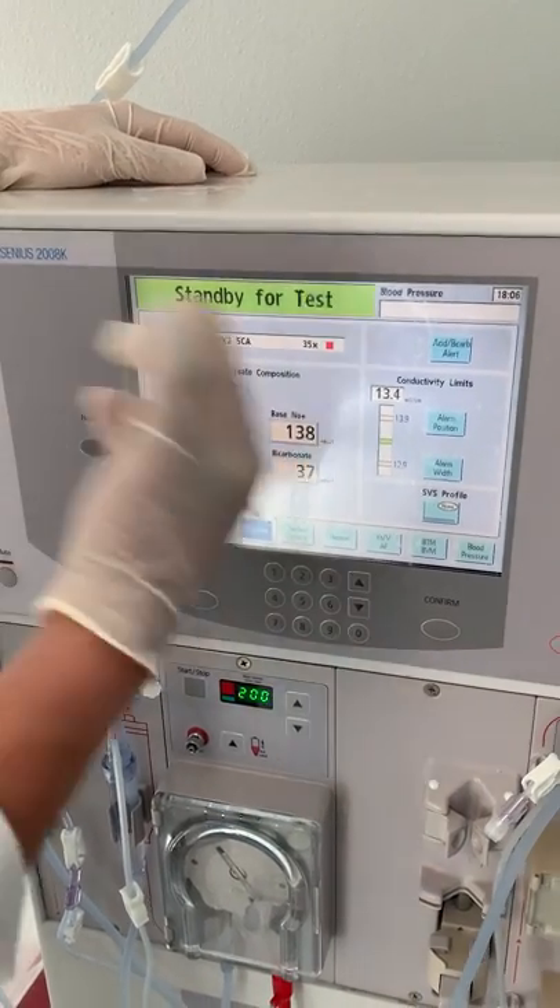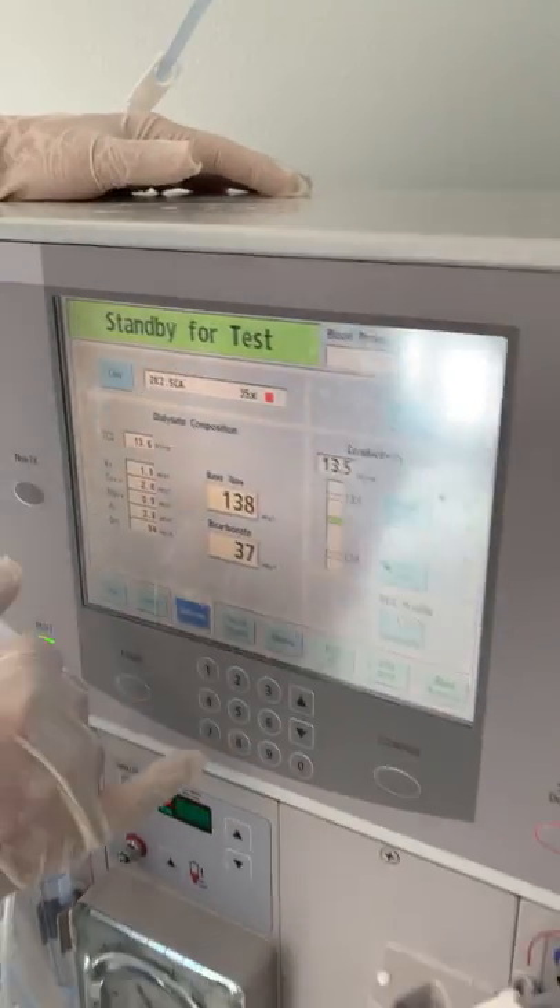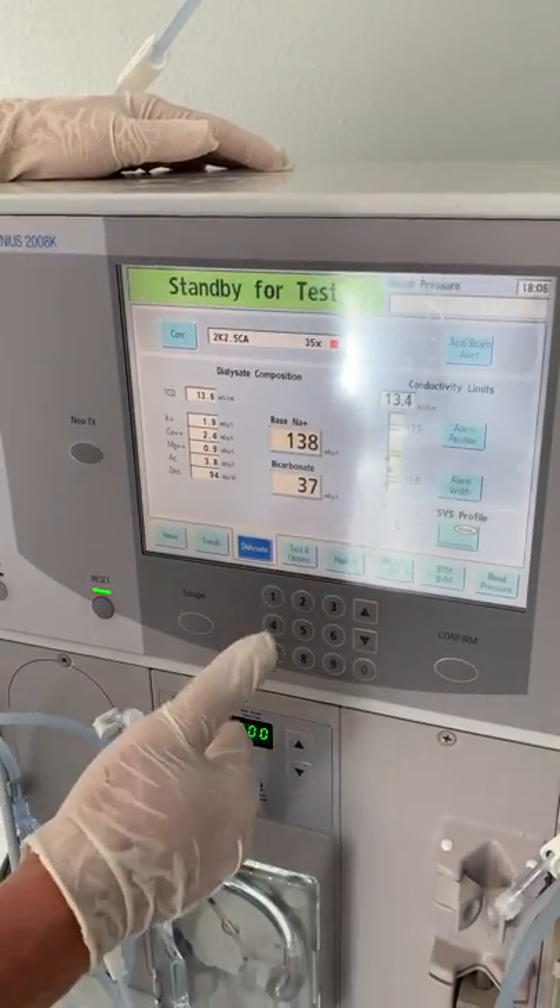The machine will now say 'Standby for Test.' In the morning, you can either wait for the machine to test by itself or you can go ahead and test it yourself.